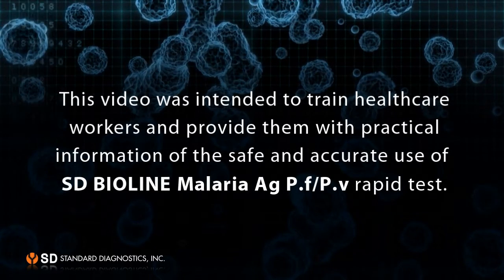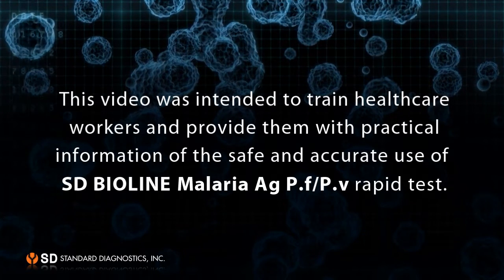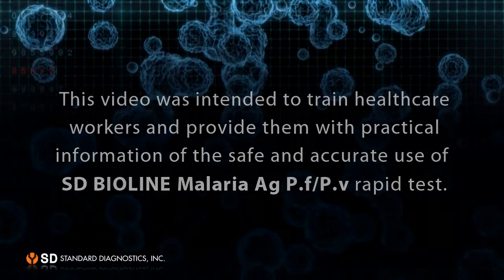This video is intended to train healthcare workers and provide them with practical information on the safe and accurate use of the SD Bioline Malaria Antigen PF/PV rapid test.